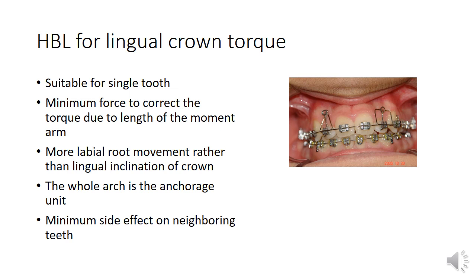And the cons for this design is its time-consuming fabrication. However, if you consider that its range of action is so high that when you do it only one time, it can go the whole way, and this will compensate the time you spend to make it.